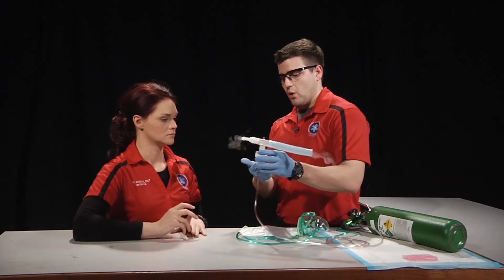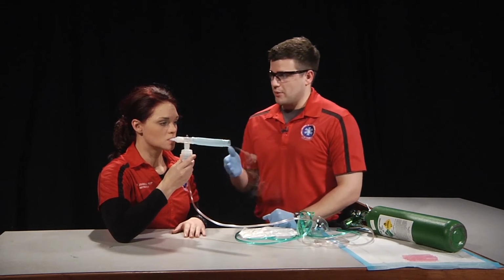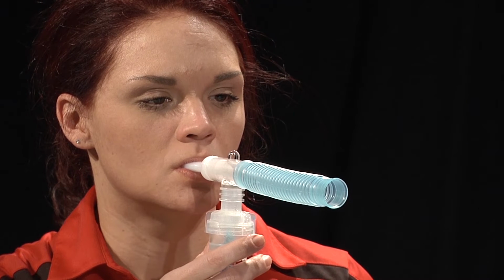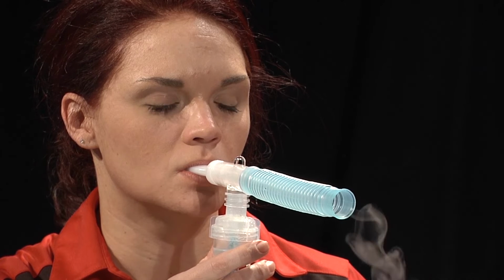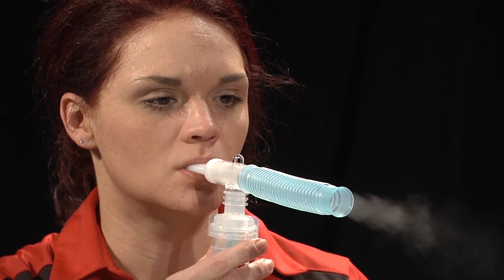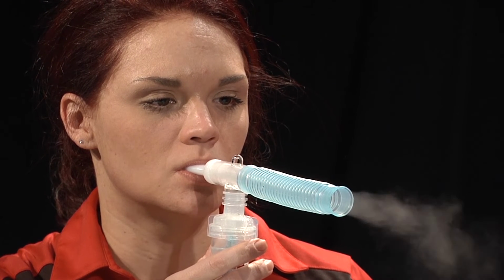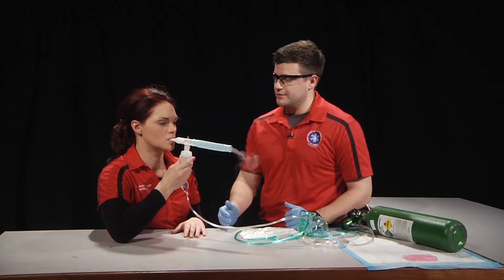Ma'am, go ahead and firmly hold this up to your lips. The mist that you're seeing is the medication that we're administering to you. The goal of this medication is to help you breathe better. What we want you to do is inhale for 2 seconds and exhale afterwards. By inhaling for that 2 seconds, you're allowing the medication to reach the bottom of your lungs, so we're getting the best results of that medication.